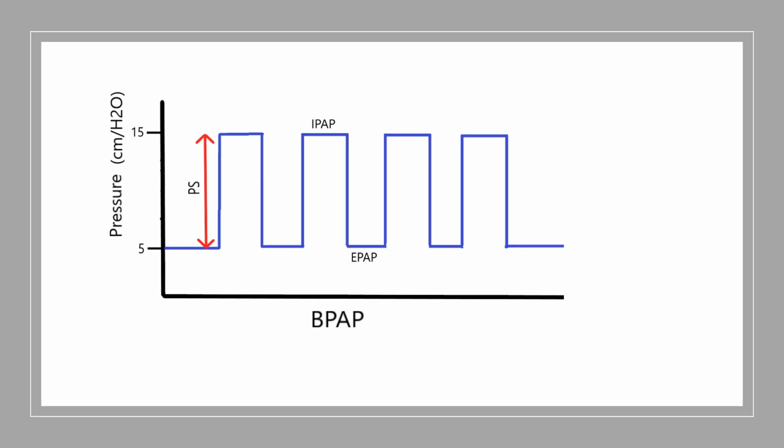So in any patient that has work of breathing, I would argue that BiPAP or BPAP or bilevel or true non-invasive CPAP plus pressure support, there's a million names for it, which also should be illegal in my opinion, that they have so many different names for the same thing, because all it does is confuse providers. But in essence, when we're talking about BPAP, we're talking about two pressures.